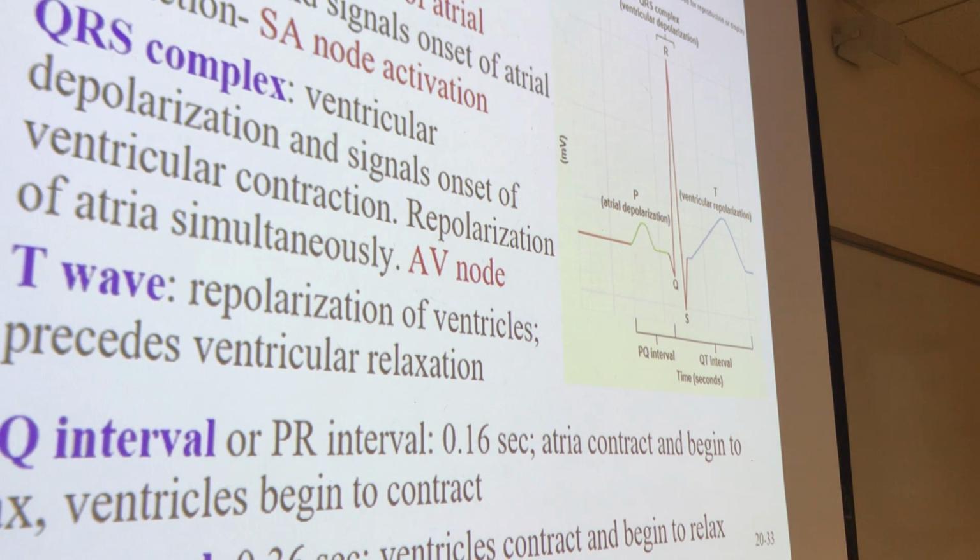So in ECG, we see three main waveforms that are important. The first one is called the P wave. The P wave is a sign of your atrial depolarization. So the atria is depolarized. Now, what else is it a sign of? Why do the atrial muscles depolarize? They depolarize because the SA node has fired, and the SA node is stimulating the whole cardiac cycle.